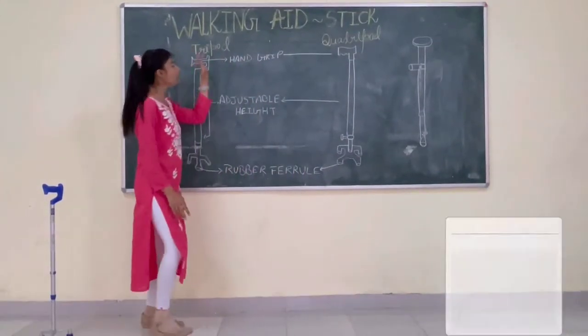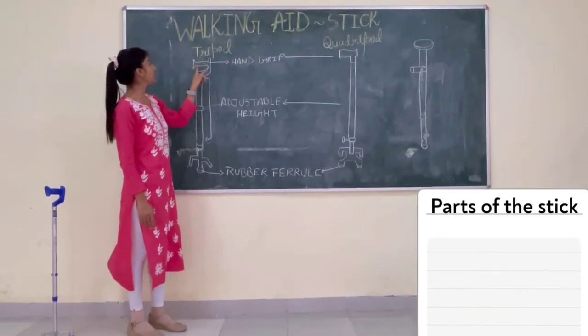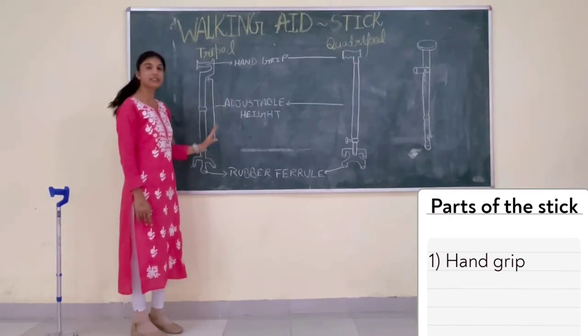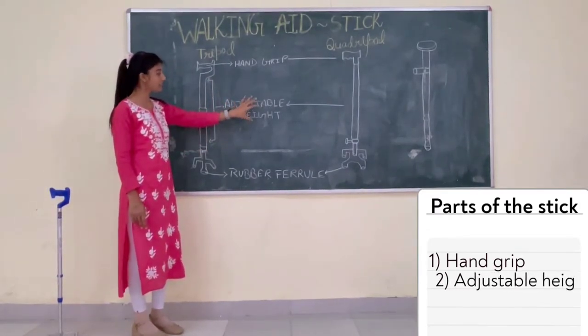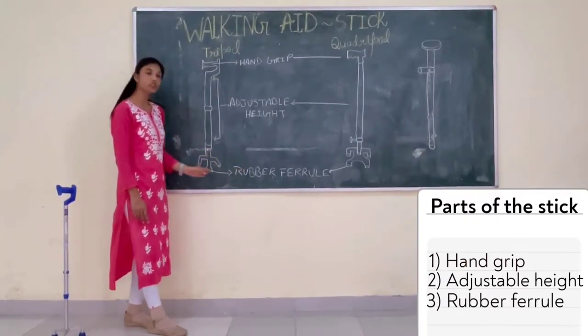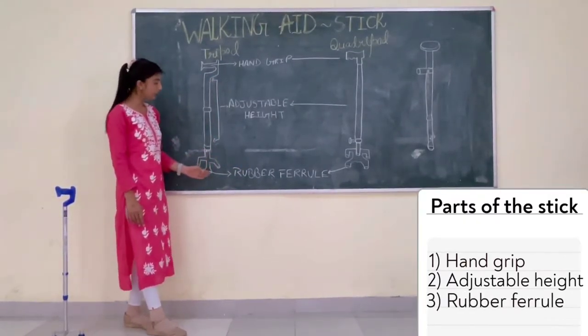Now the parts of the stick are: first one is called the hand grip. The area from where we can adjust the height is called the adjustable height. And the last one is the rubber ferrule — the base of the stick is called the rubber ferrule.